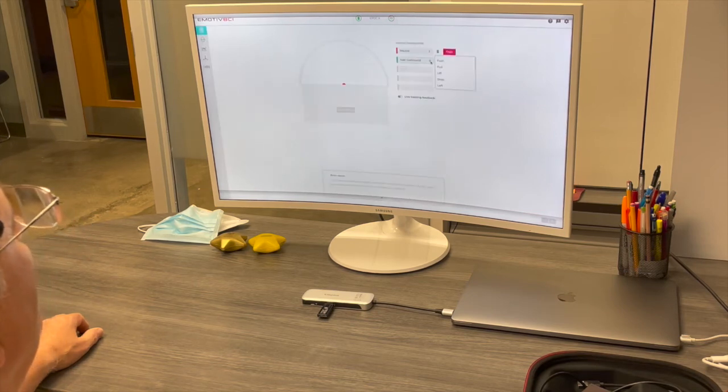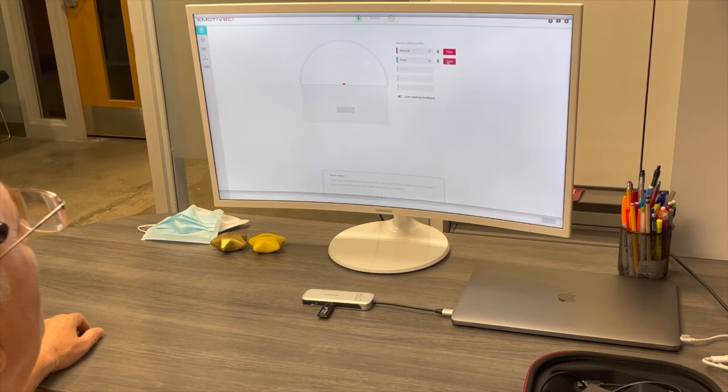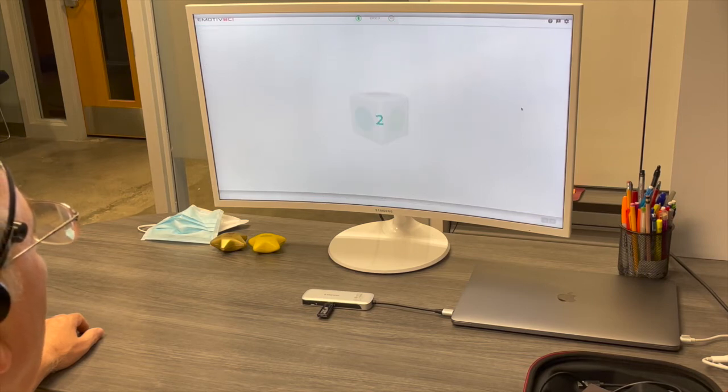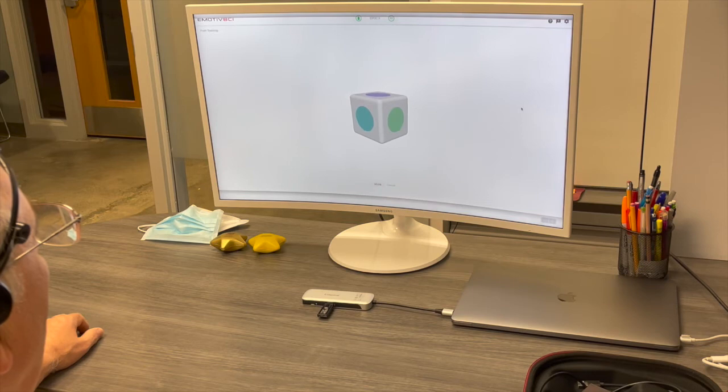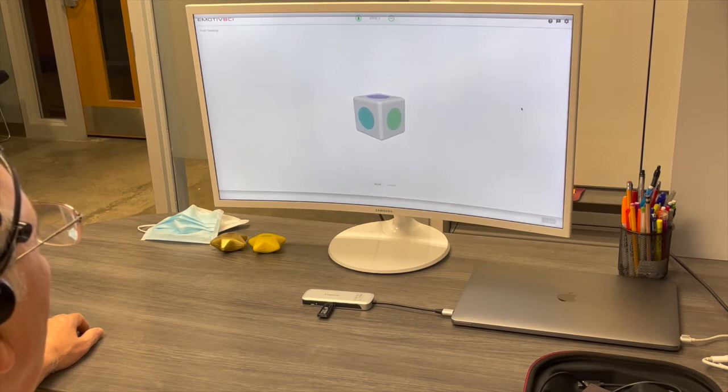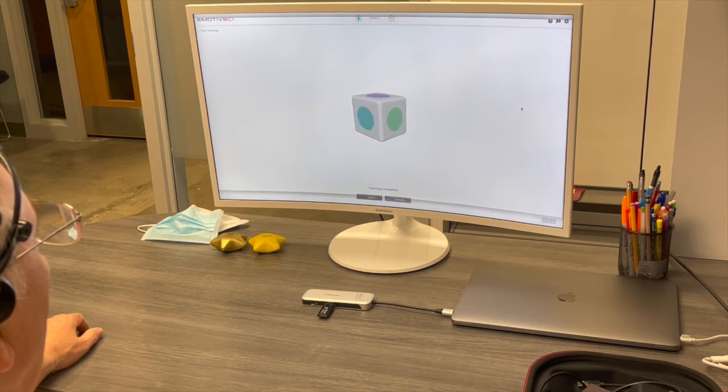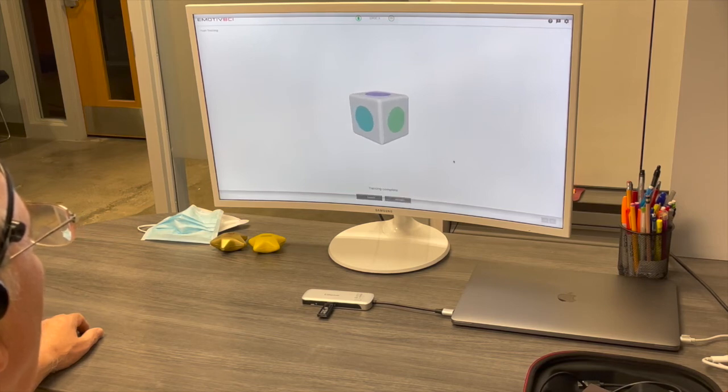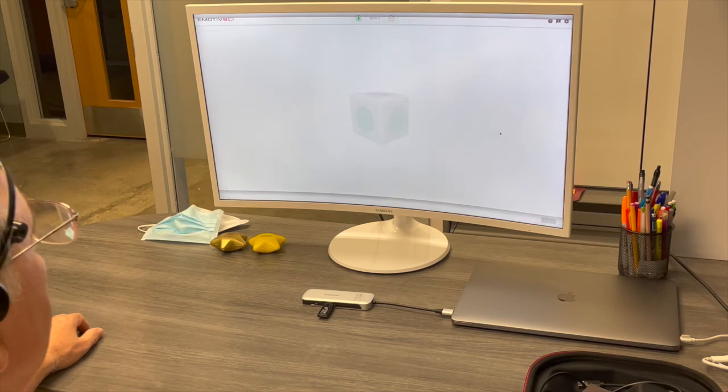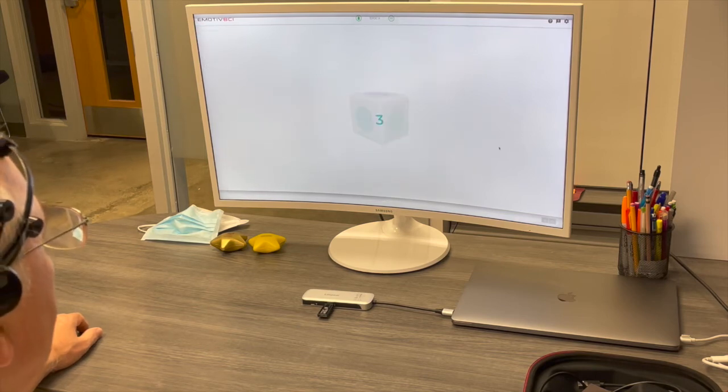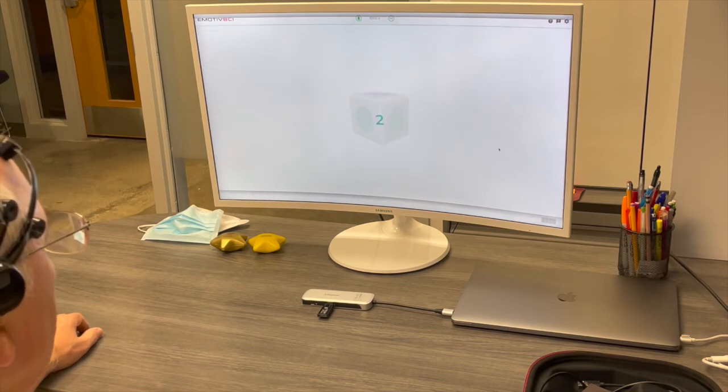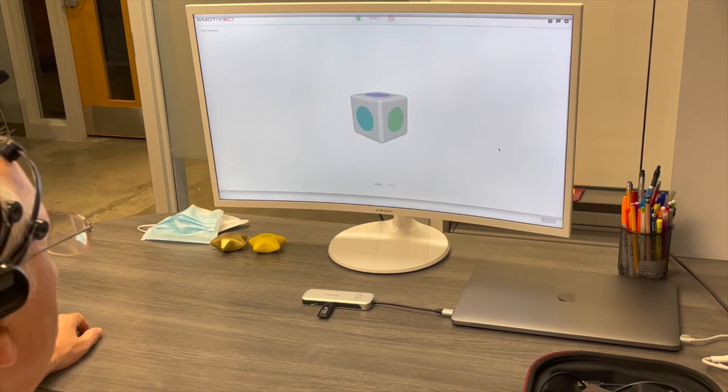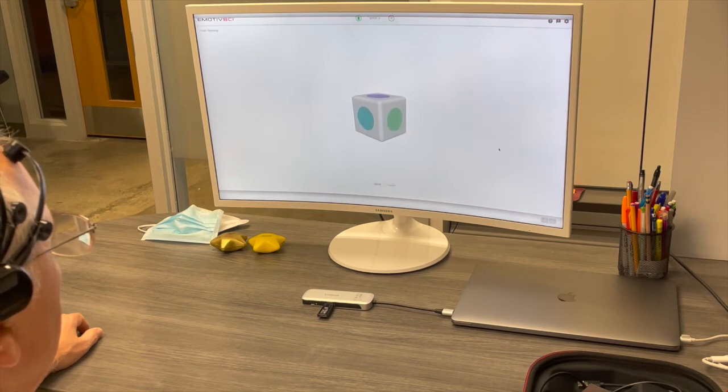And then you can select which kind of movements you want to simulate. In this case, again, I start simulating pushing the three-dimensional cube away, as you see it.